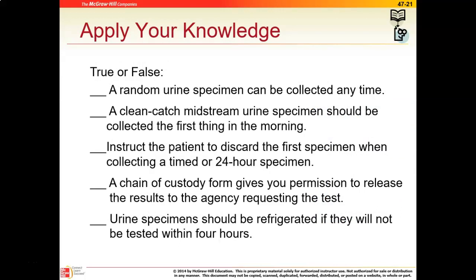Okay, true or false? A random urine can be collected at any time. Random means any time, so that is true. A clean catch midstream urine specimen should be collected first thing in the morning. Okay, well, we talked about that. Clean catch is when we are doing the wipes and when we're checking for an infection. The first thing in the morning would be a first morning urine specimen.